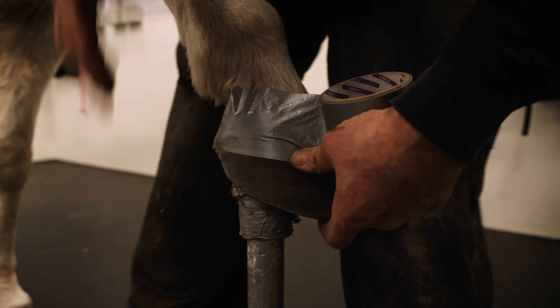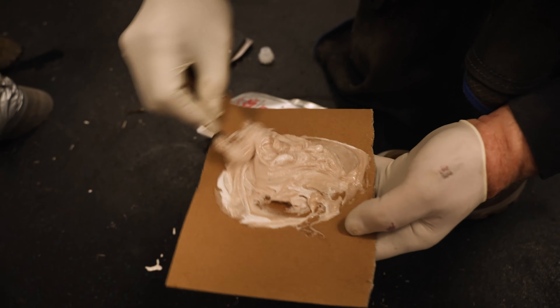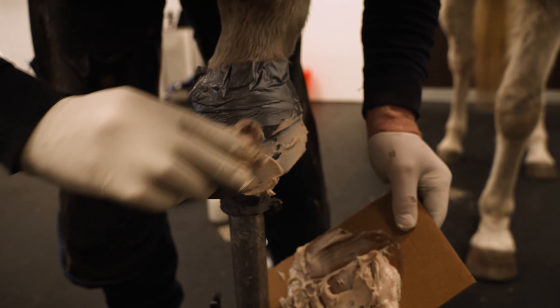Next, apply an acrylic adhesive to the outer wall, adding additional adhesive in the heel areas as this will help locate the tape.